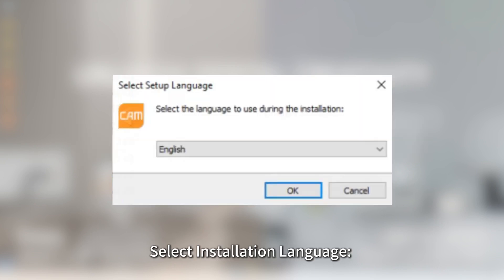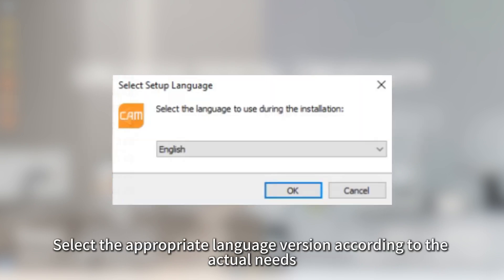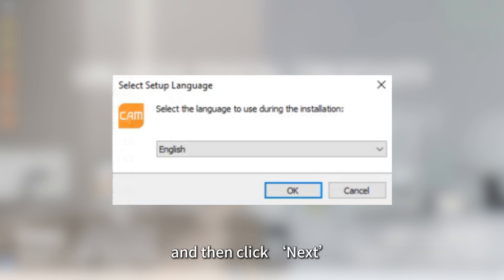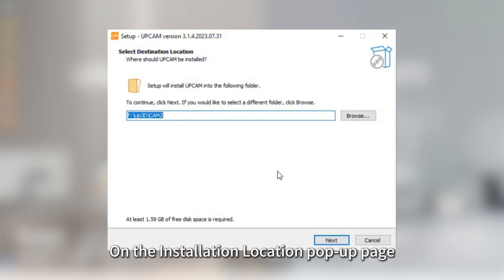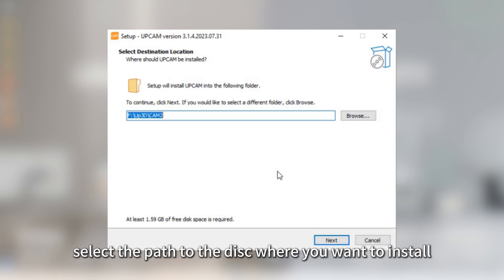Select Installation Language. Select the appropriate language version according to your actual needs and click Next. Select Installation Location. On the Installation Location pop-up page, select the path to the disk where you want to install.